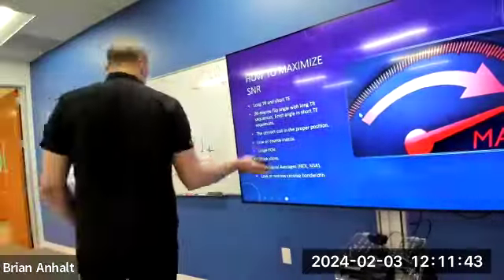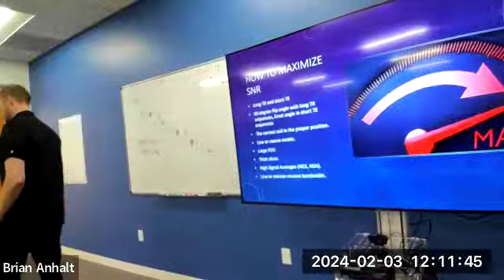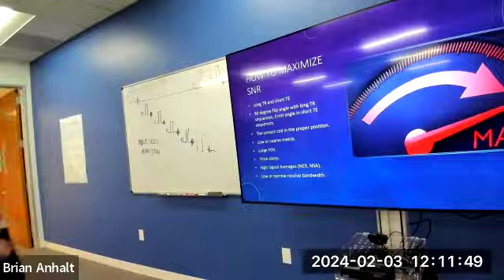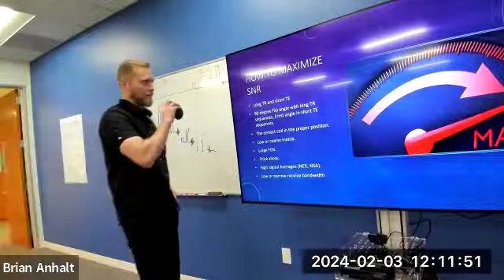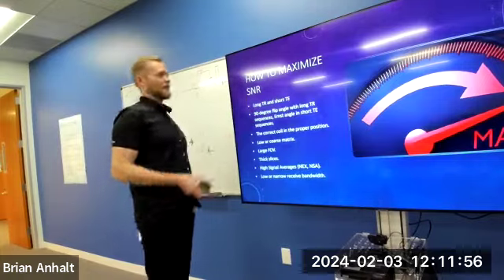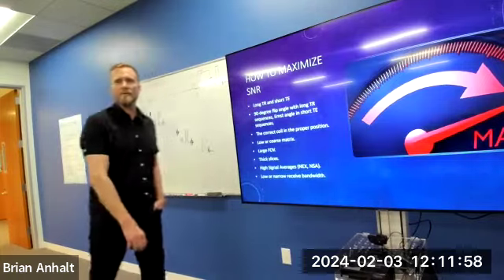So all of that was about SNR. I know we talked about more things as well, because I wanted to get you guys to understand how everything relates instead of just jumping around. But how do we maximize SNR? We wanted to get the best SNR ever. We want a long TR and a short TE.